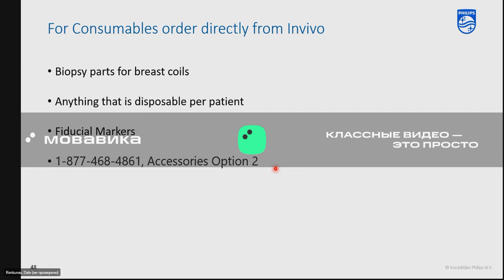You don't need to have like a 12NC, non-FRU part or something. Tell them what product you have and tell them what you need. They'll get you set up, and that is the quickest and easiest way to get the parts for those specific things.